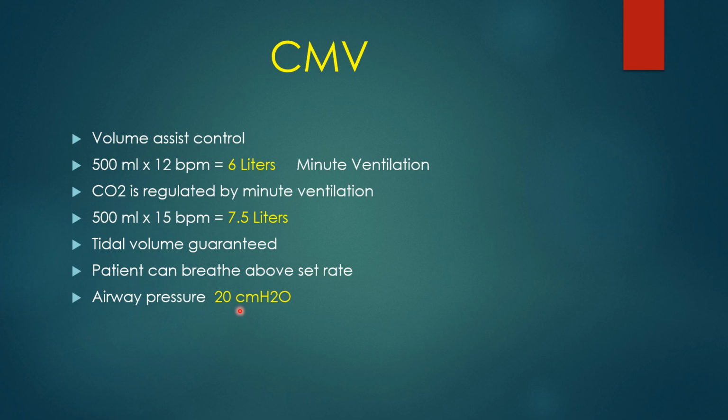Okay, and so that's considered a safe pressure. We like to keep that pressure less than 30. So everything's looking pretty good on this patient here. He's got a good blood gas. Pressure's not too high.